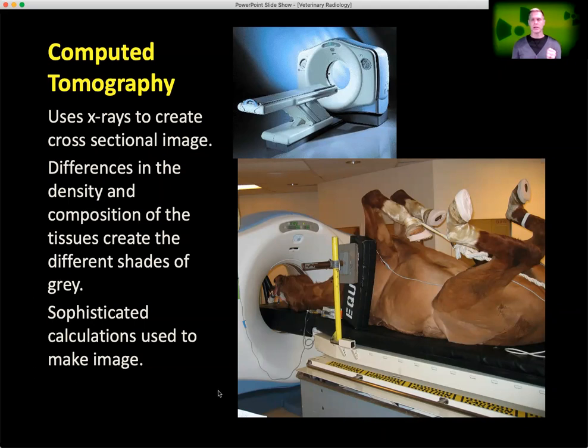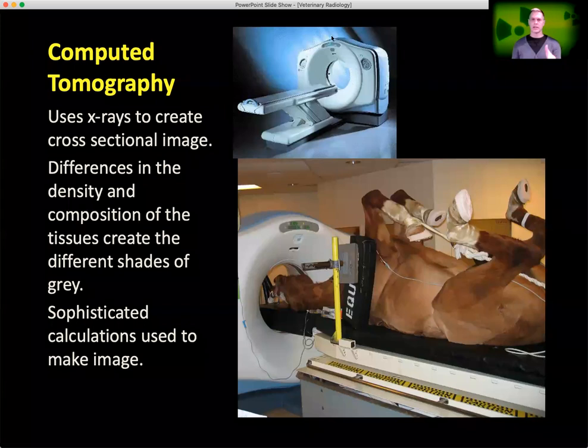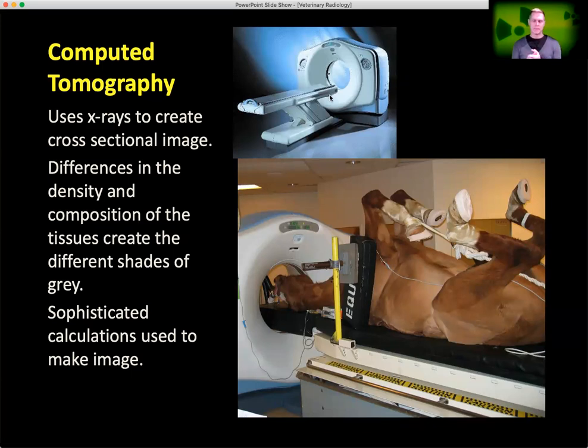This requires a lot of mathematics that the computer does for us to reconstruct the image, because what's happening inside the CT scan is there is an X-ray tube, and this X-ray tube will rotate around the patient, constantly emitting the beam of radiation. On the other side of the tube are some detectors that act just like an X-ray plate to actually help receive the X-ray photons that have been generated. And it looks for the differences in their energy and how many of them make it through the patient. And through some complicated mathematics, actually builds the image on the screen.